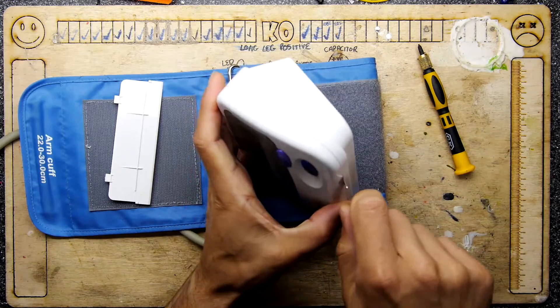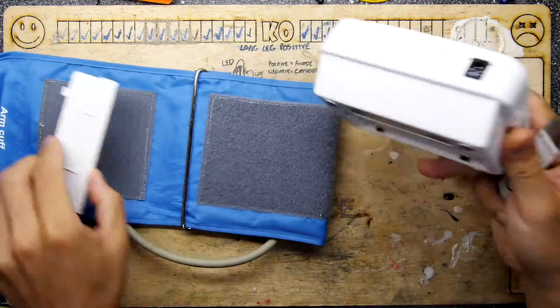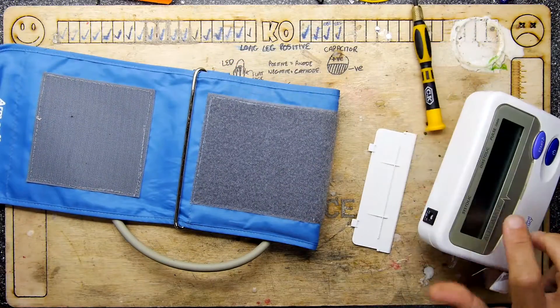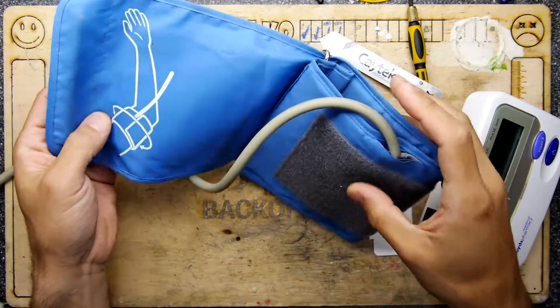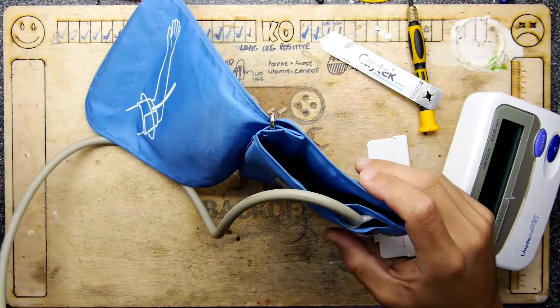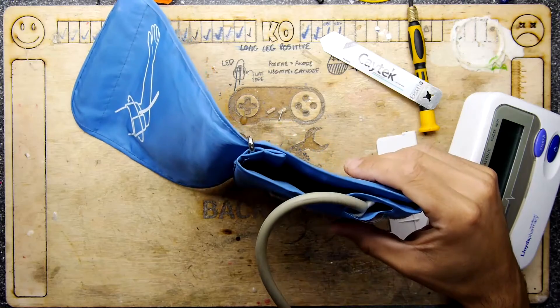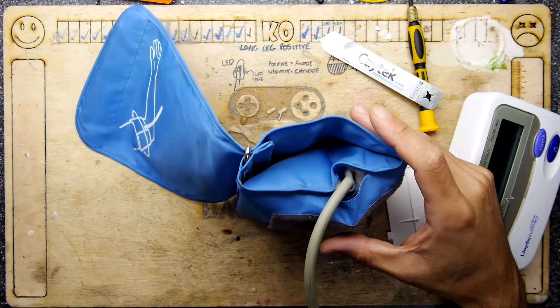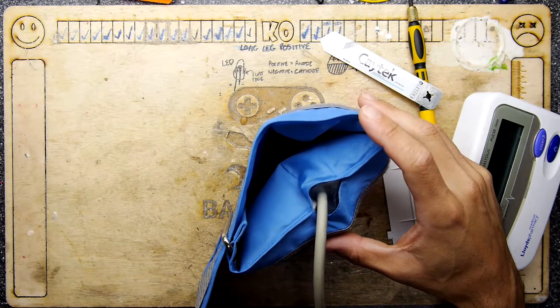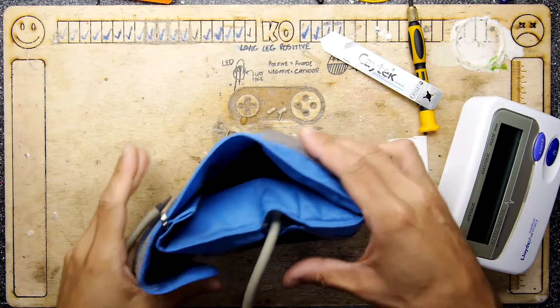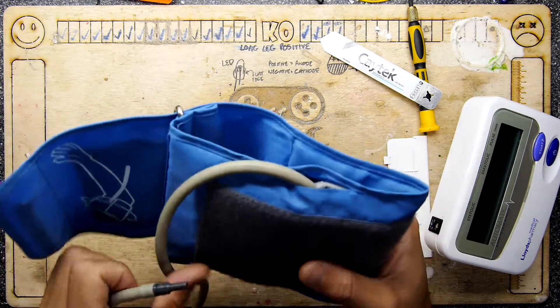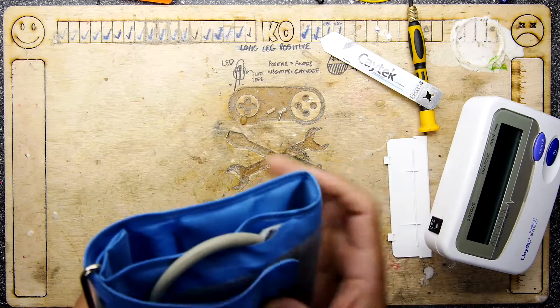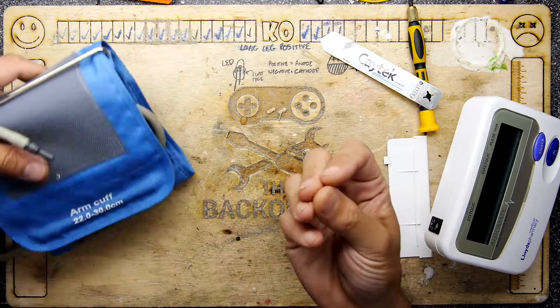So the idea is that you put pressure, if you haven't used one by the way, so there's a little pump in here. And you have this thing on your arm. Everybody must know how these work. And you see how I'm blowing in there, right? So blowing in the pipe, it's inflating that up. So once it's inflated, I think it listens. It can hear like your pulse.